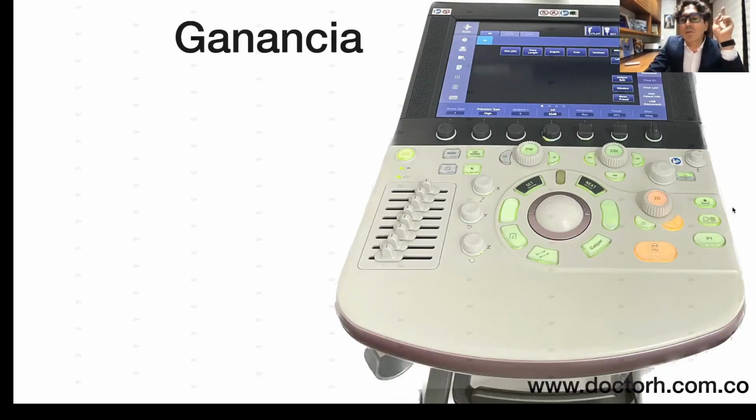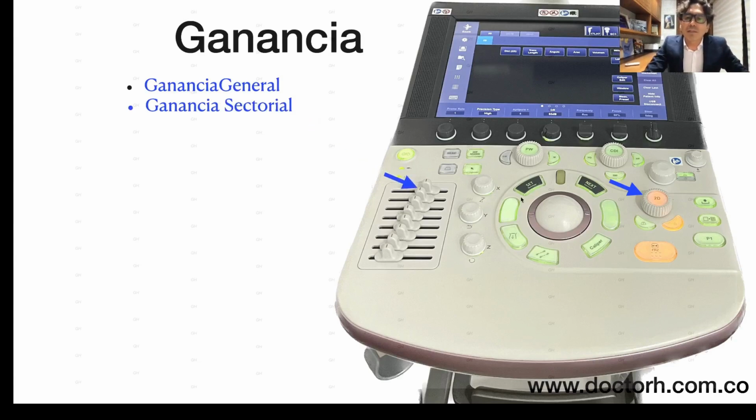The gain has two ways of being handled in our ultrasound machine, which is the general gain. When I turn this knob, I'm going to make the whole image look, as in the previous image, brighter or less bright. And this other one, which is the sectorial one, basically by means of these keys I can make it brighter in the segment that I want. That is, by manipulating, as its name indicates, by sectors or segments, I can give only that piece a greater range of gain.